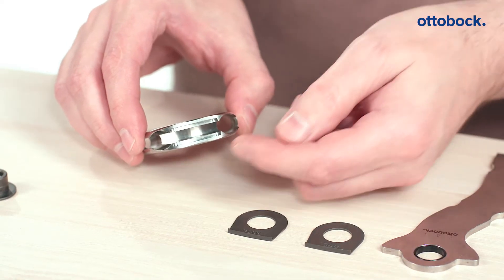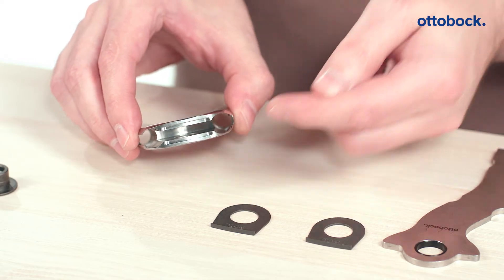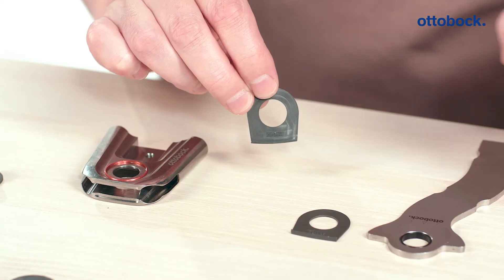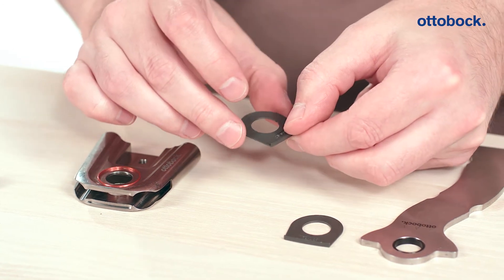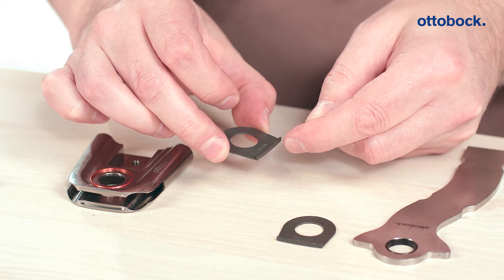Assembling the axial washers is very simple. A rectangular retainer is located on the interior and exterior of the bottom of the joint. The axial washers have a mechanical stop on their undersides, which fits perfectly into the retainer on the joint and ensures the optimum fit of the washer.